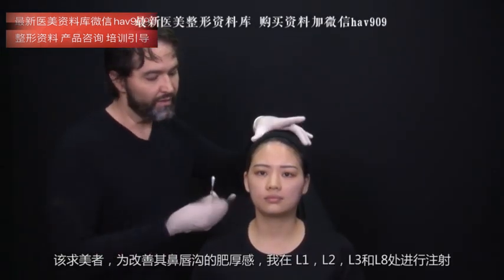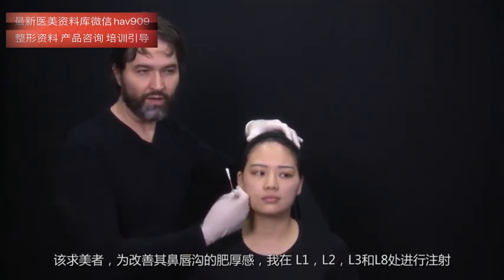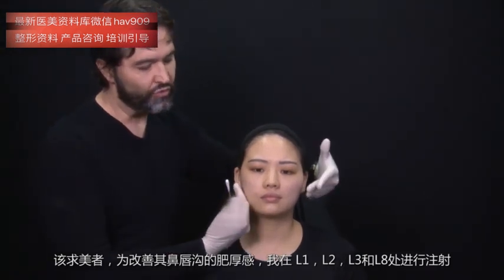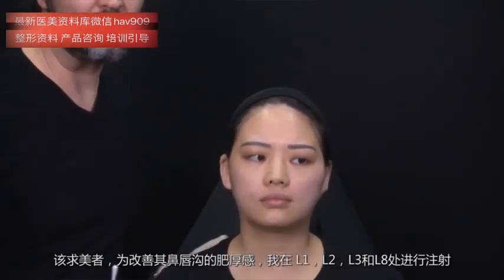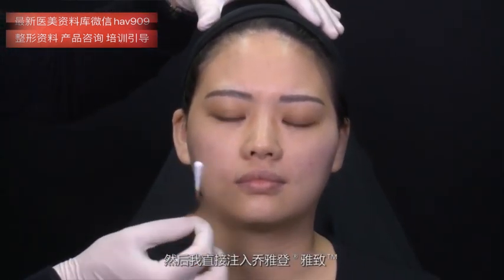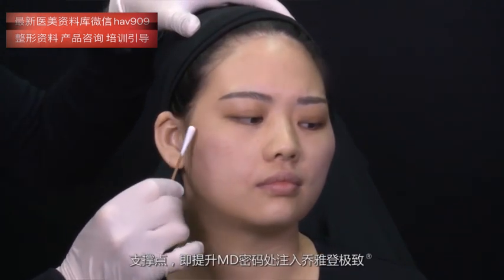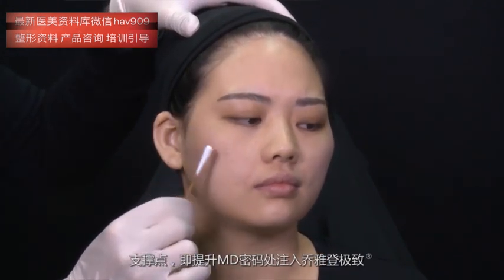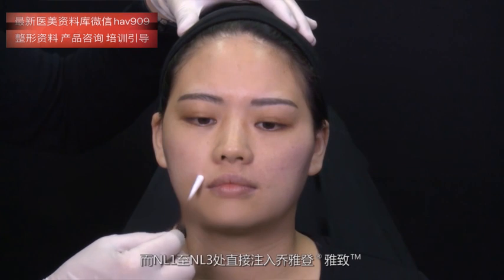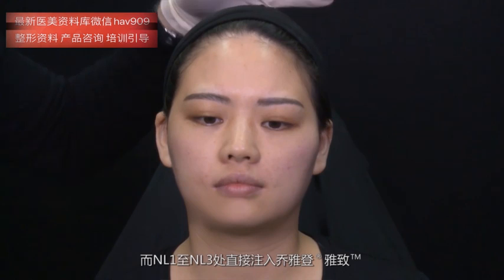Now, in her case, I injected L1, L2, L3, and L8 to change the heaviness over the nasolabial folds. And then, directly, I injected Ultra. Ultra Plus in the supporting points, the lifting MD codes, and Ultra directly into NL1, 2, and 3.